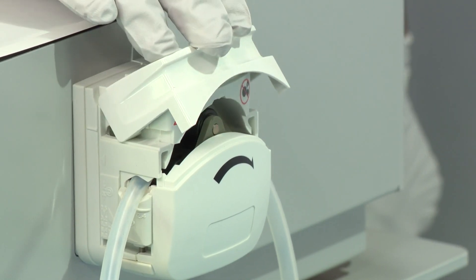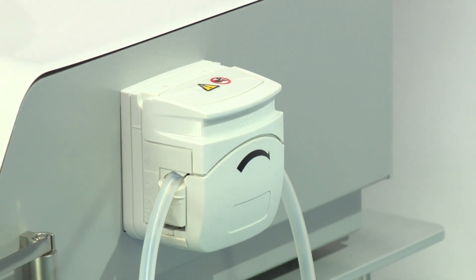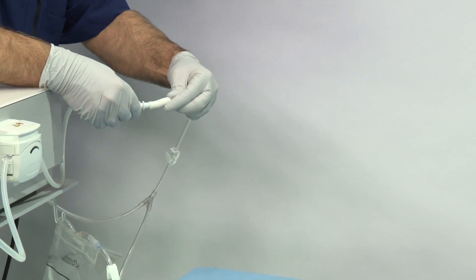Make sure that the output tube is not twisted or under tension when placed in the peristaltic pump device head. Close the pump. Be careful not to pinch the stone catcher output tube when closing the pump. Connect the stone catcher output tube end with the conical connector to the optional fluid management system or to your fluid disposal system.